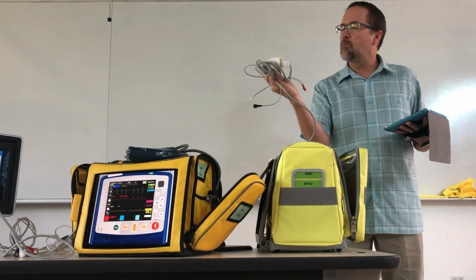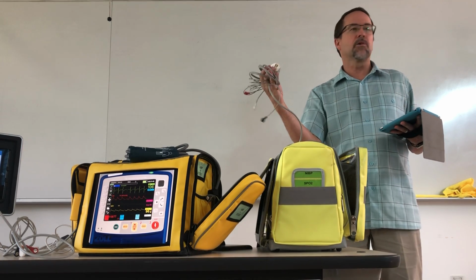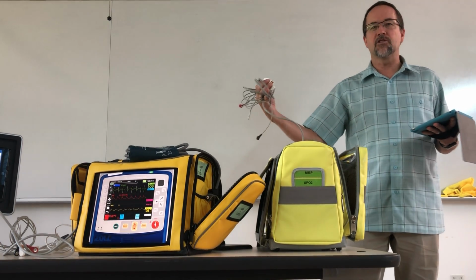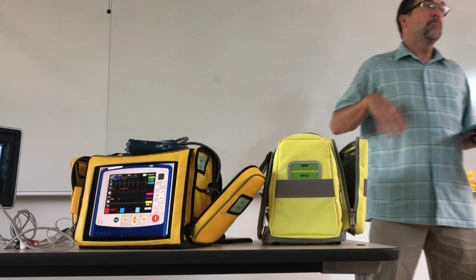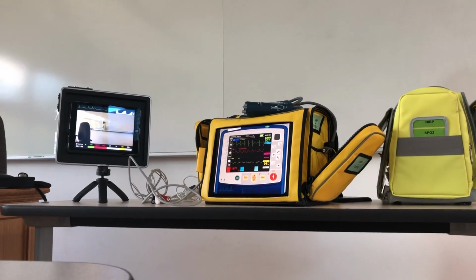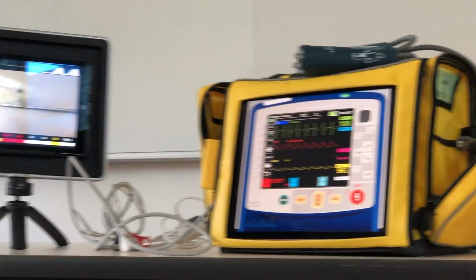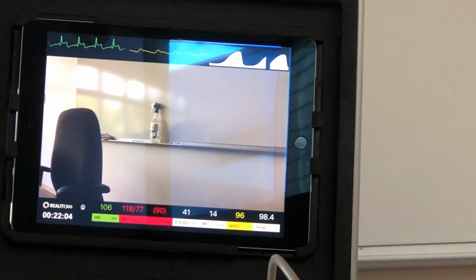I don't know if that's more similar to the Philips, but similar in that you've got your leads, and then if you want to plug in the rest of the 12 lead, you have to plug it into the little add-on thing. It doesn't take our students long to figure that out, but for CE classes where you're working with people who use these things all the time, one little thing that makes it seem less real just kind of gets in the way. So if it's the exact same cables, that would be kind of cool.